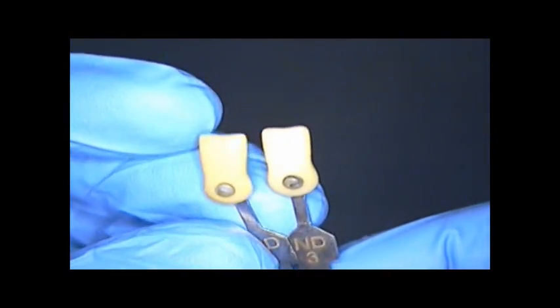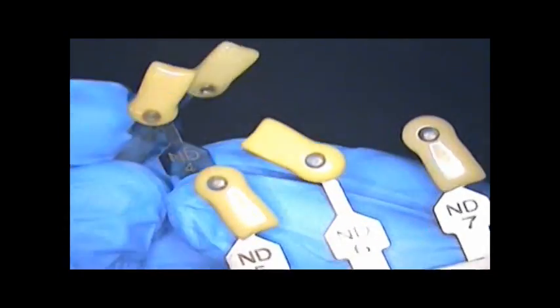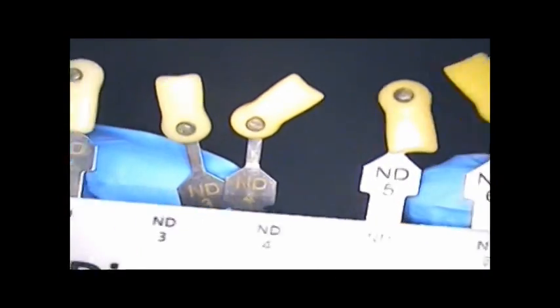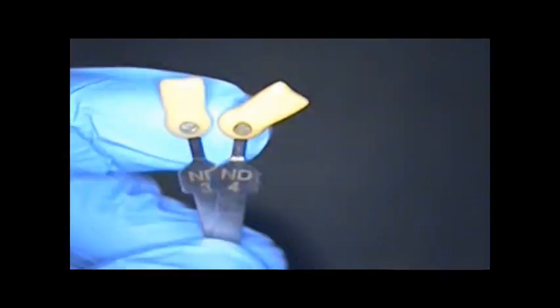Some other things to have ready: the ND3, ND4, excuse me, it must have been an ND4 on the stump shade. So I take a photograph of both the stump shade and the regular shade guide, send that to the lab, and this way they have everything they need along with the impression. So Ivoclar, again, you wish they would have a little better stump guide. It seems like these colors are very chromatic, and they could probably afford to add to the number of shades to select from. So here we are, coming up around 5 minutes.